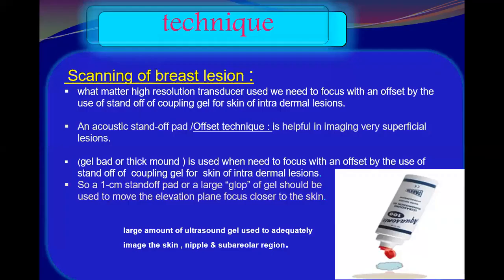Okay, so again, if we could identify lesions, sometimes we might need to use an offset technique. What is an offset technique? Or acoustic stand-off pad technique.